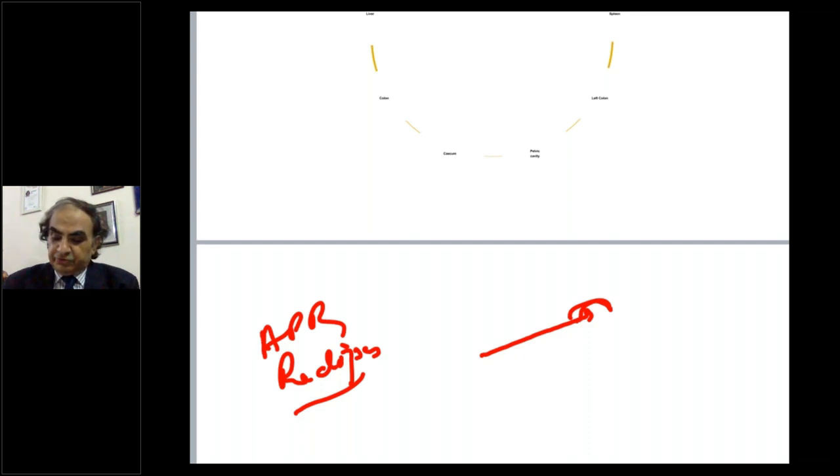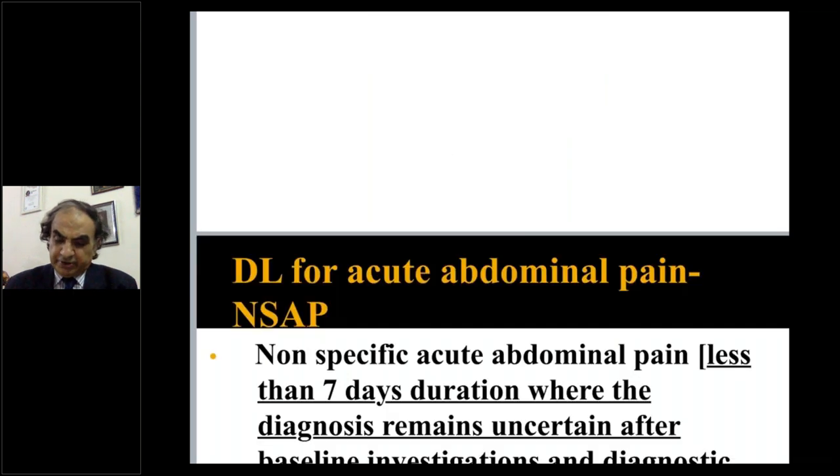So what do you do? You just swipe it proximal to the sacral promontory. It won't come back. You just have to swipe it up. And as it falls proximal to the sacral promontory, it won't go down. Now you can do the pelvic assessment accurately. Take the scrapings, take the biopsy, depending upon what you're doing.